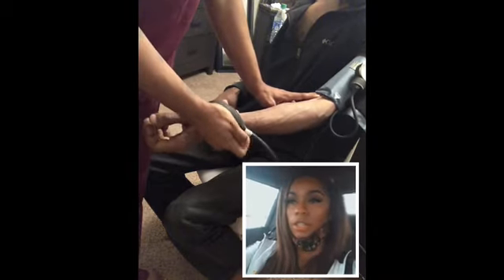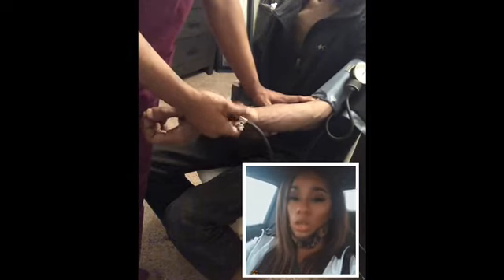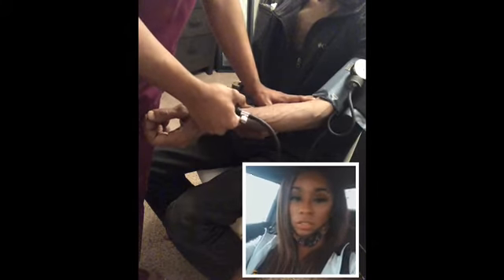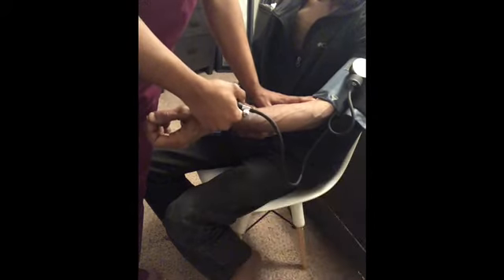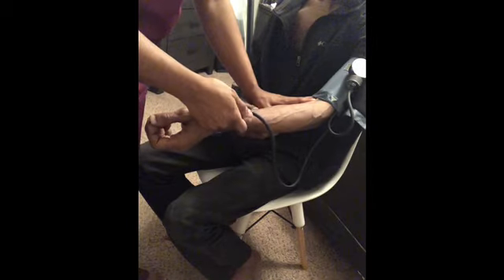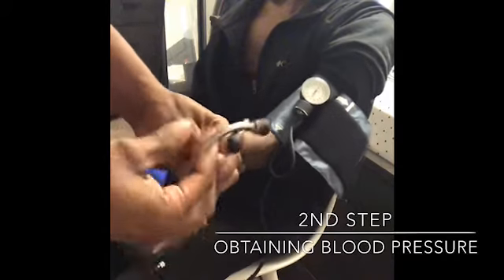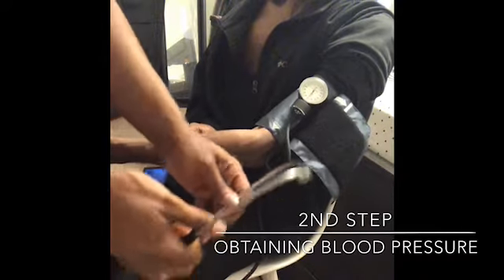Occluding the artery. So you're going to put the blood pressure cuff on and you're going to pump it up until you can no longer feel the pulse. Once you have reached the occluding point, you're going to remember the number and release the blood pressure cuff. Once you determine the occluding point, you are now ready to take the blood pressure.